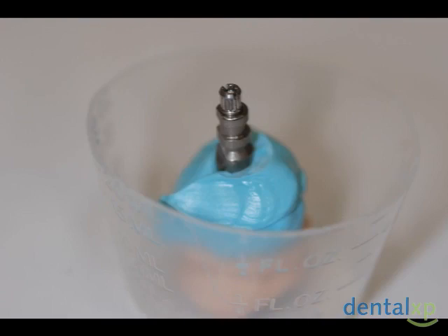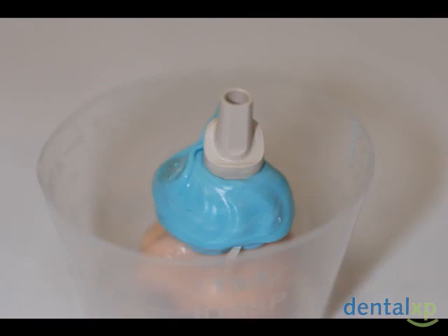This study will show the benefits of using a contoured healing abutment to develop a proper profile. Here, an impression coping is used that is the same diameter as a normal round healing abutment. This is an impression coping used of a contoured healing abutment.